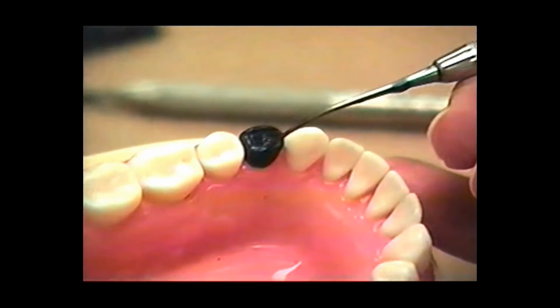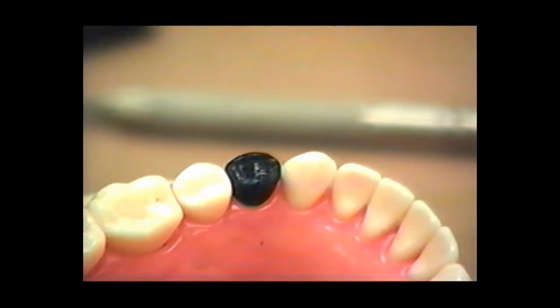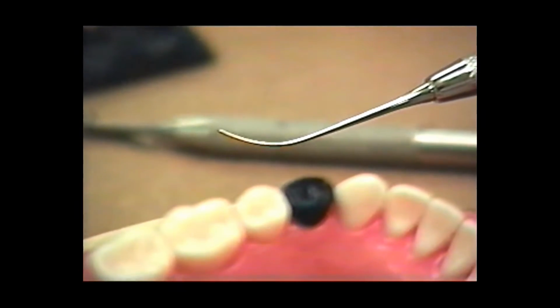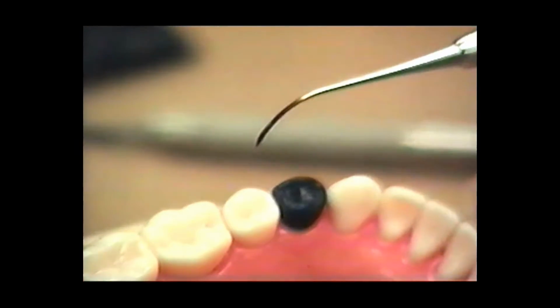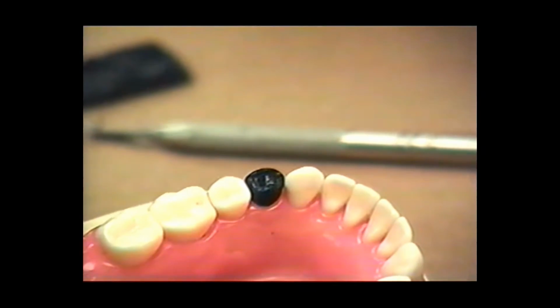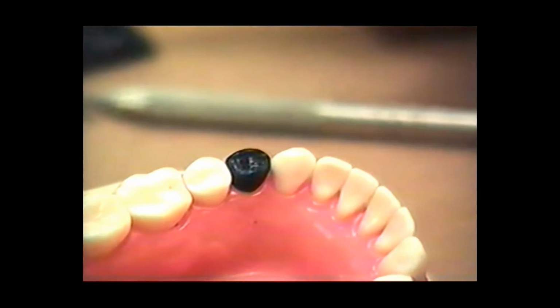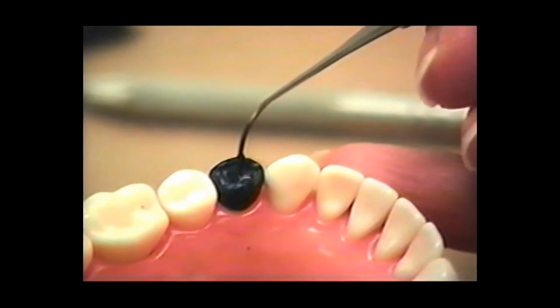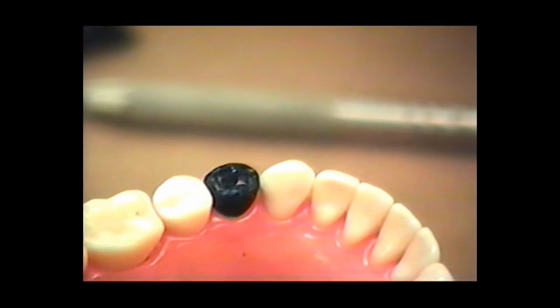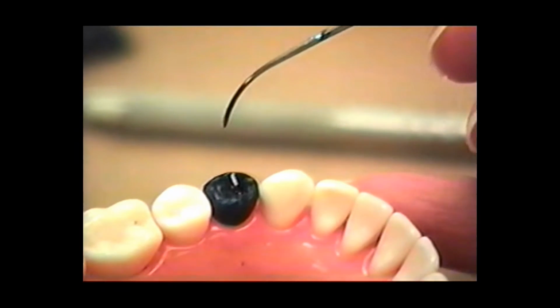So what I might need to do now is look at it and see, do I need more triangular ridge? I might need a little bit more. I add a little bit more wax if I need it. At this point, you might want to switch to the dripper that's a little smaller, either this one, and if you really need to do some very fine anatomy, you can use this really small end of the dripper. And so I just need to add a little bit of a triangular ridge, so let's see what we can do there at the buccal. And I'm just going to lay it right on there. It's not hot enough, so we're going to heat it up a little. And just add that. Okay?